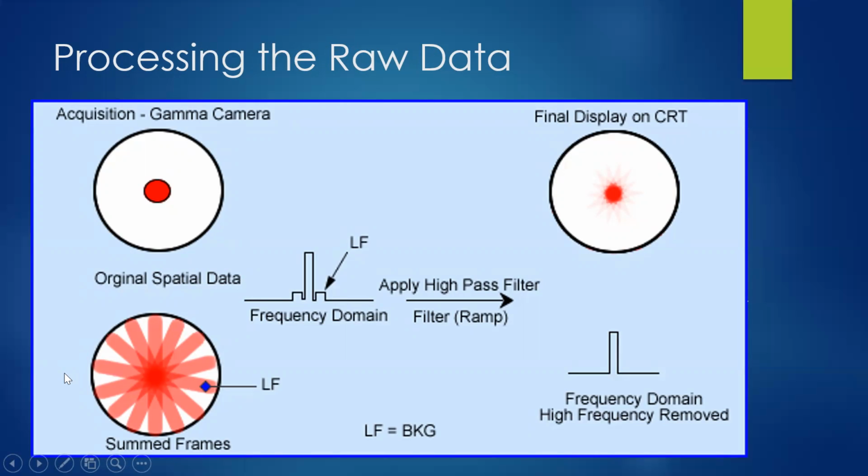So if I take a profile assessment and go right across this and evaluate the count distribution, I'm going to see a peak here, lesser activity here, and no activity here. As it crosses over into the light red, pink zone, it pops up, and then when I hit the hot zone, it pops up even further to where the true activity of the object is.